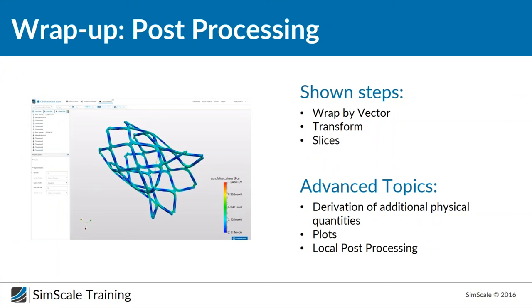I showed you how to use the warp-by-vector filter, how to change time steps, and how to use the transform filter and slices to get insights into the stent. There are some additional things like derivation of extra physical quantities using the calculation filter, or creating plots and diagrams — but those require local post-processing. What you have learned so far is enough to create your own simulations and perform post-processing, and if you have questions you can use our forum.